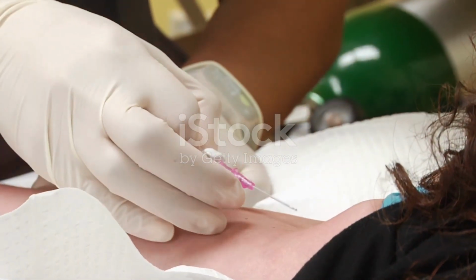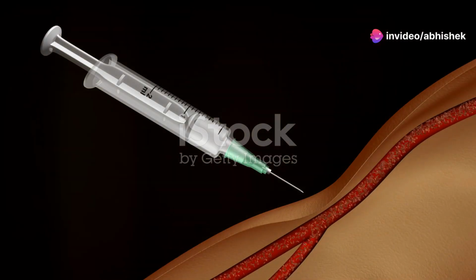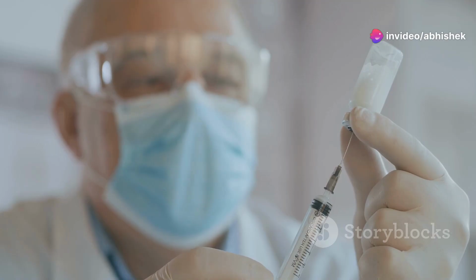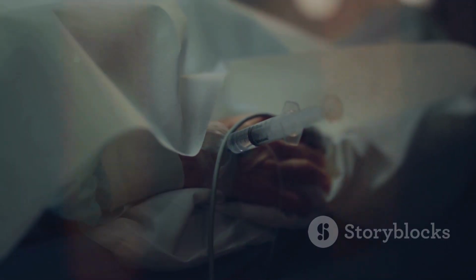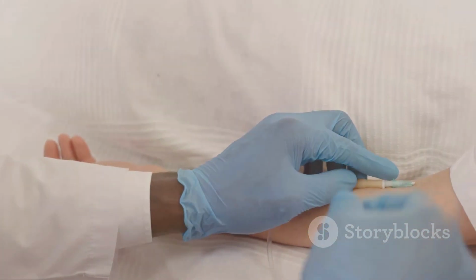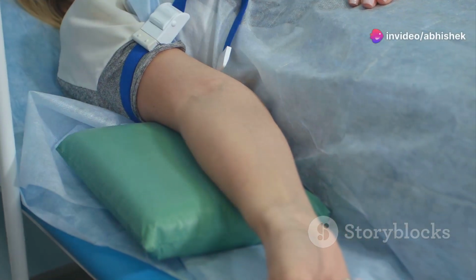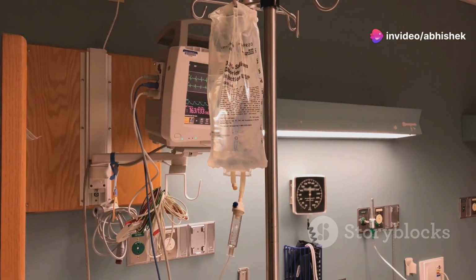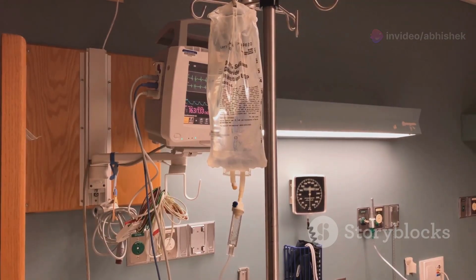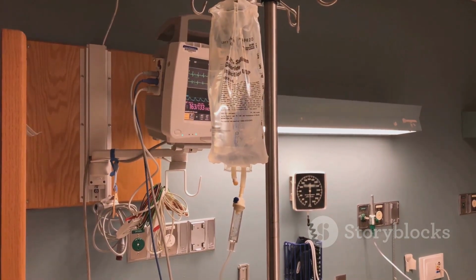IV injections deliver medication directly into the bloodstream. This allows for immediate effects. Trained healthcare professionals administer IV injections. Common sites for IV injections include veins in the hand, which are easily accessible, and veins in the arm, specifically the antecubital fossa, which are larger veins for higher volumes. IV injections are used for a wide range of medical purposes. These include fluid replacement, medication administration, and blood transfusions.